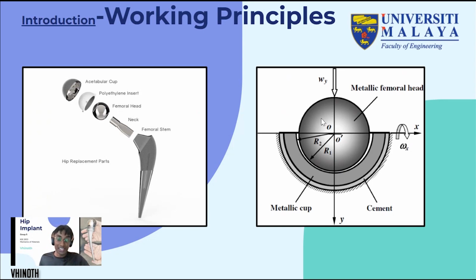The surgically installed hip implant usually articulates the femur to the acetabulum, the same way as the hip joint, which is also known as the acetabular femoral joint. Thus, the implant carries out the function of connecting the lower extremities of the body to the axial skeleton. This hip implant allows movement in all 3 major axes, where the center point of the axes is the femoral head, and the 3 axes are the transverse axis, longitudinal axis and sagittal axis.